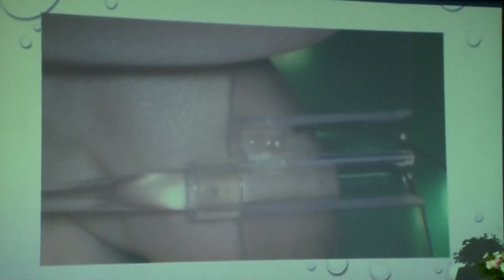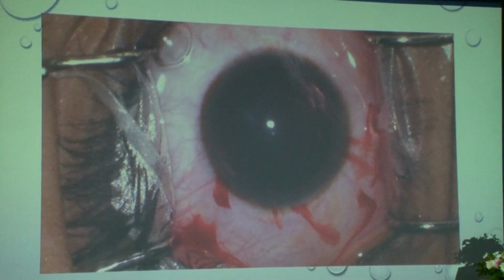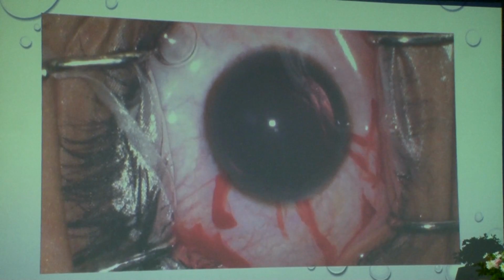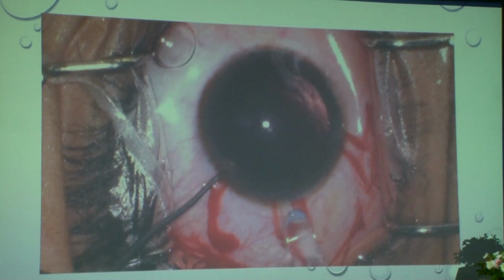The next case I'm going to skip because it's the IPCL. If time remains, I'm going to come back. What I need to emphasize with this particular video is the importance of the second instrument. I have the next two videos to show you, in case you land up in a situation where there's going to be a flip, and how you're going to manage that.